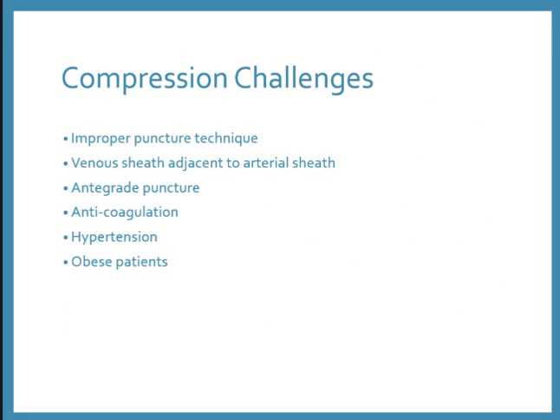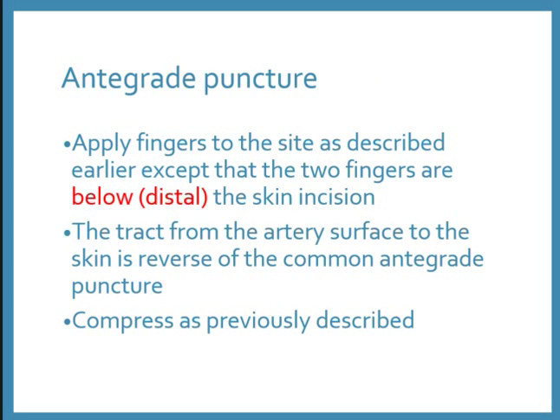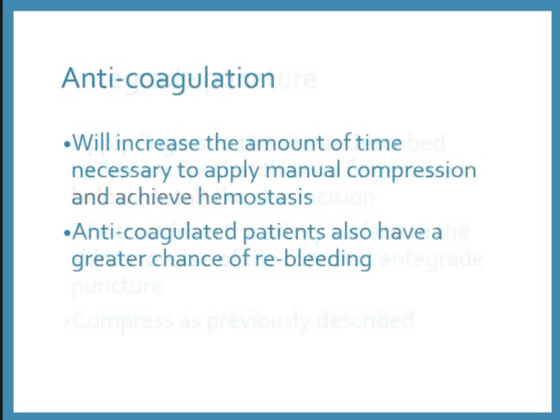There are some compression challenges. We'll talk about those. Your patient may have had an antegrade puncture. So instead of holding above where it enters the skin, you're actually going to hold distal to the skin incision because that's where it enters the artery. You'll compress it just like you would the other way. You're just going to be lower than you would for a retrograde puncture.